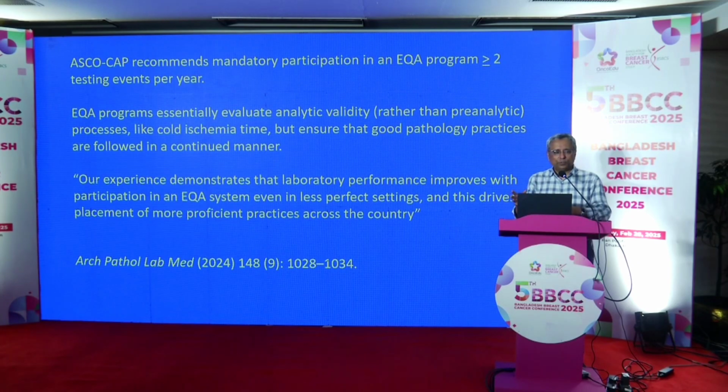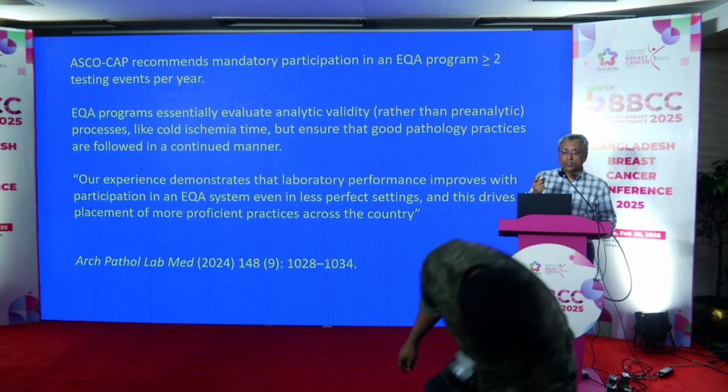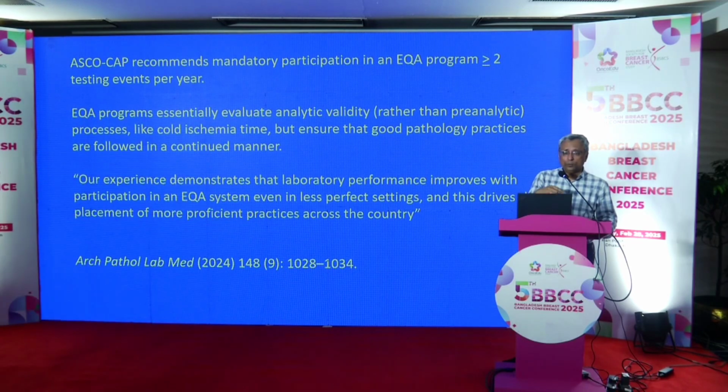So to avoid these issues, I think going back to the basics of quality control is very essential, and the sooner we do this, the better for the patients. It's actually not for the lab. Of course, the lab will benefit, but it actually benefits the patient, especially the poor patients, the cancer patients, who spend a lot of money for treatment, right? Based on your or our interpretation of immunostains.